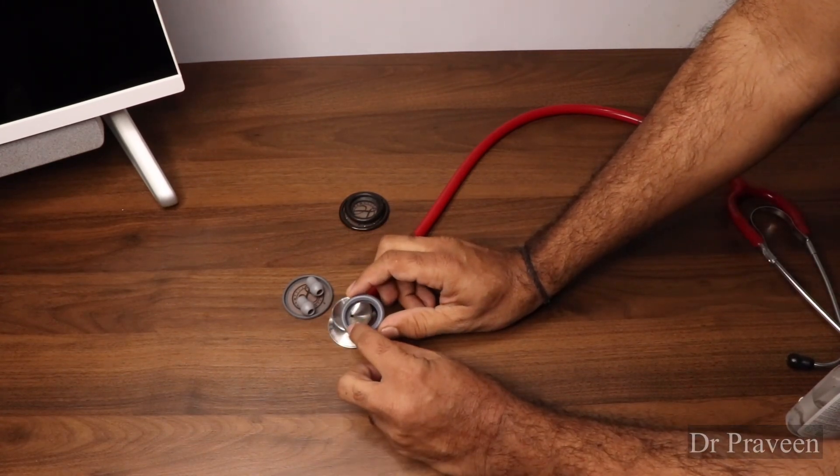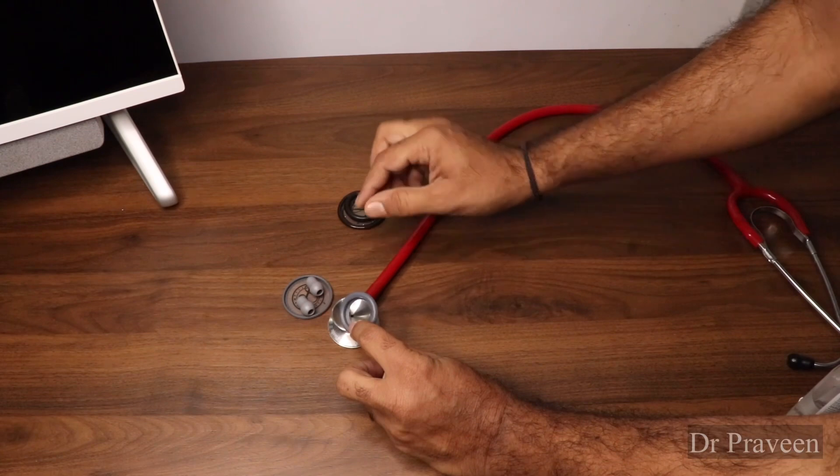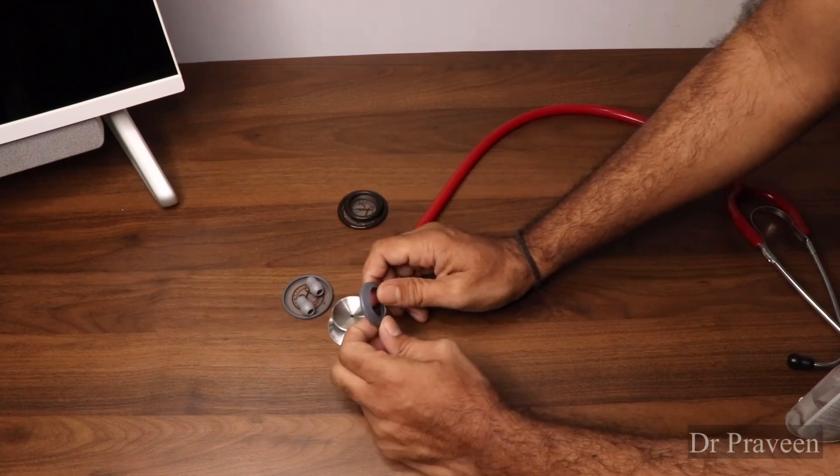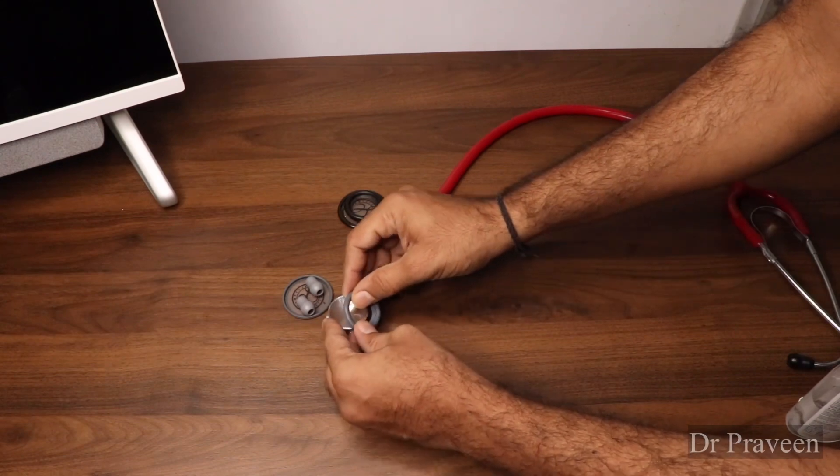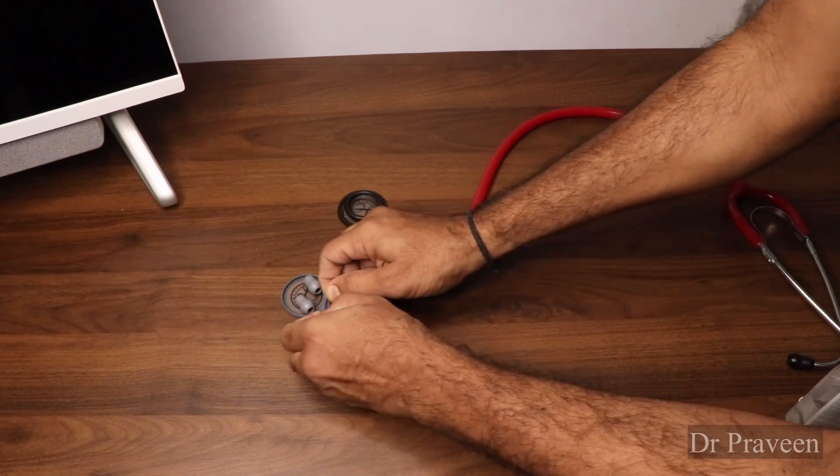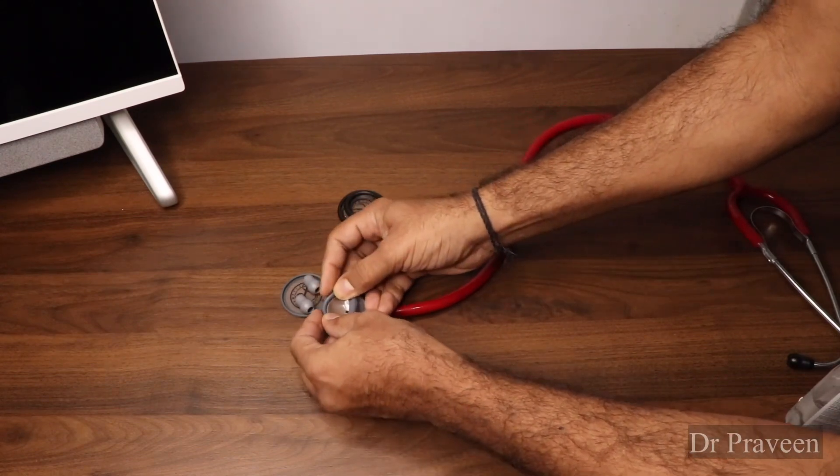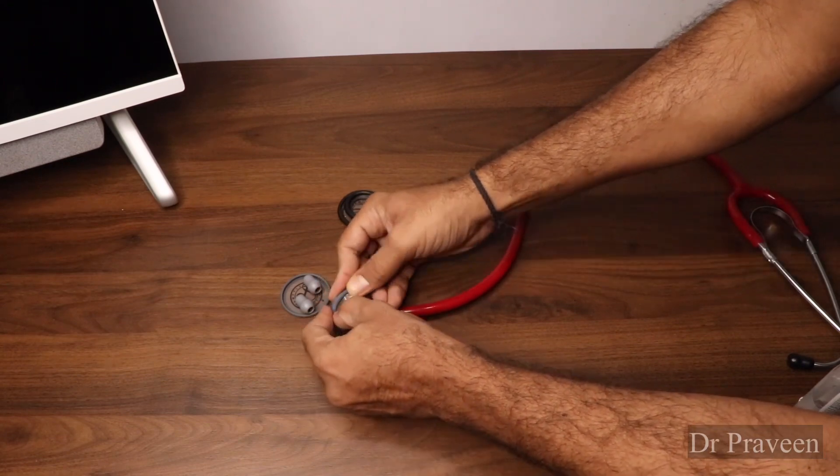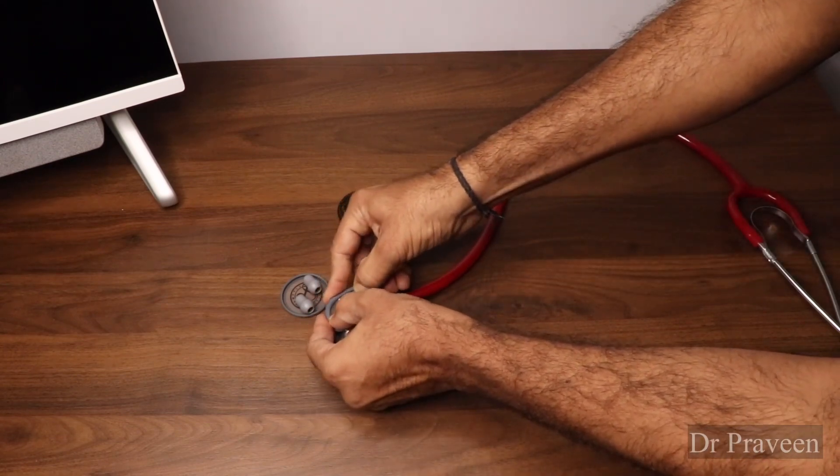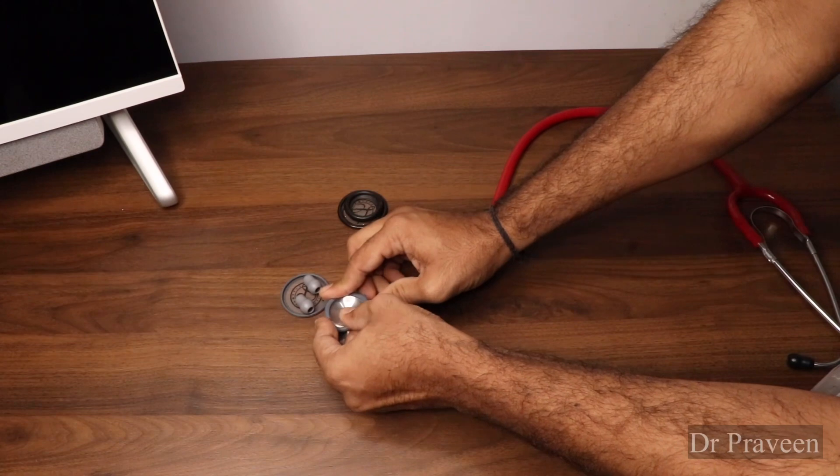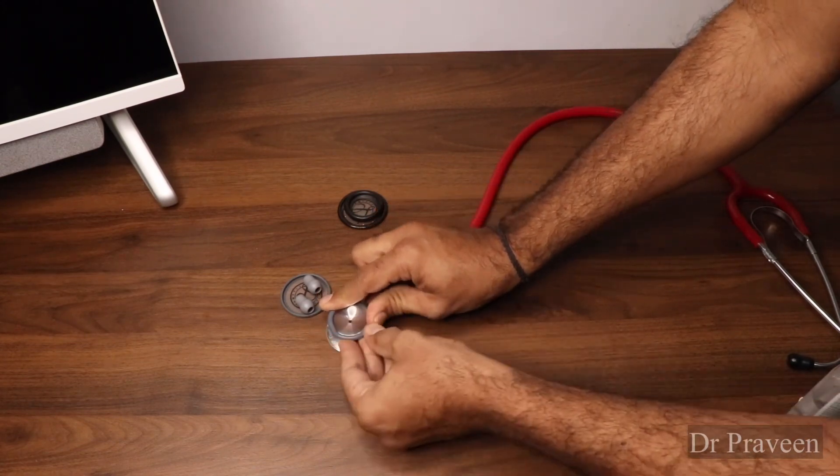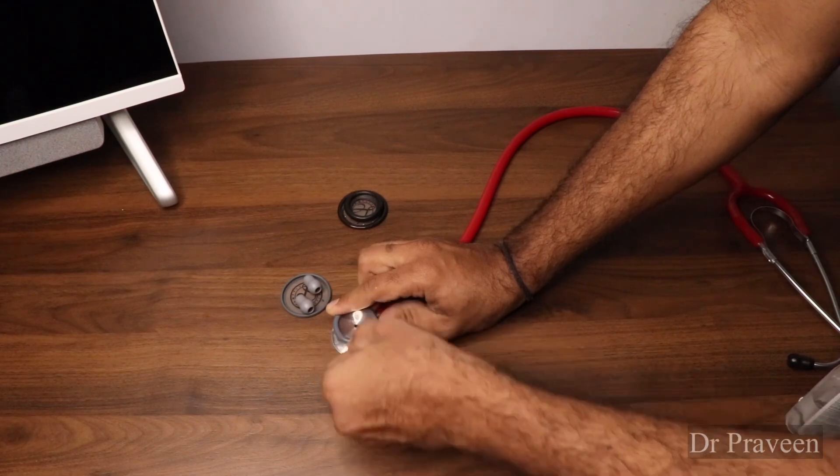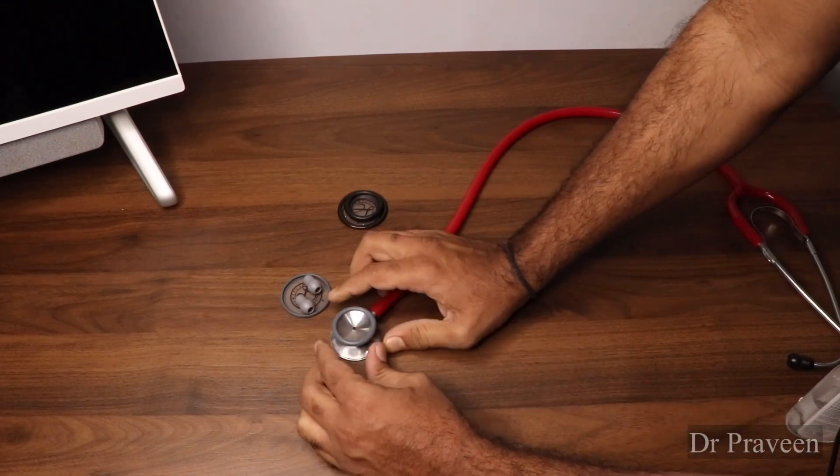The shorter one should come upward direction, the wider one should go on the back. Fine, so this is done.